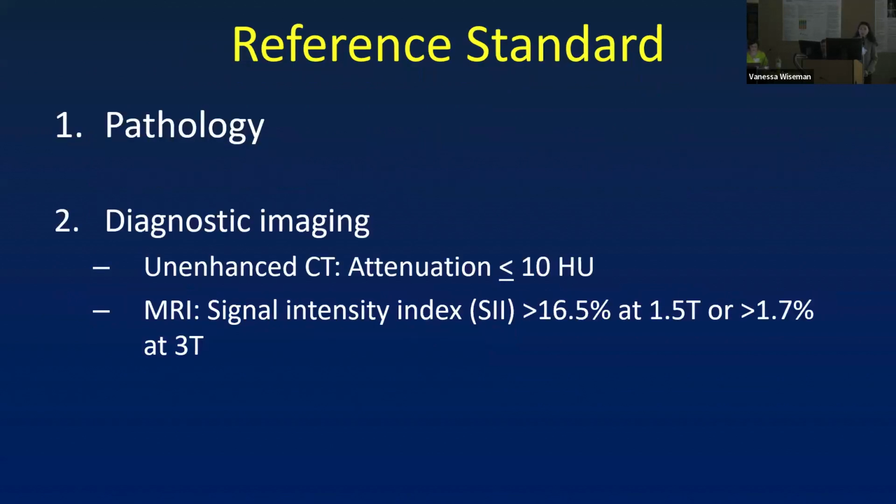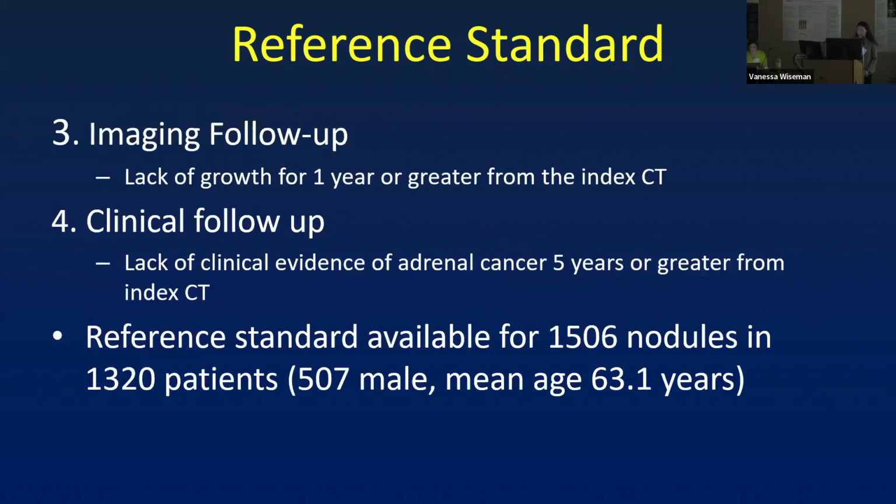Our reference standards included pathology, when available, separate imaging that was diagnostic of a lipid-rich adenoma, either by unenhanced CT or chemical shift MRI, imaging follow-up showing stability 1 year or greater from the index CT, and clinical follow-up showing no evidence of adrenal cancer 5 years or greater from the index CT. Our final cohort included 1,506 nodules in 1,320 patients.